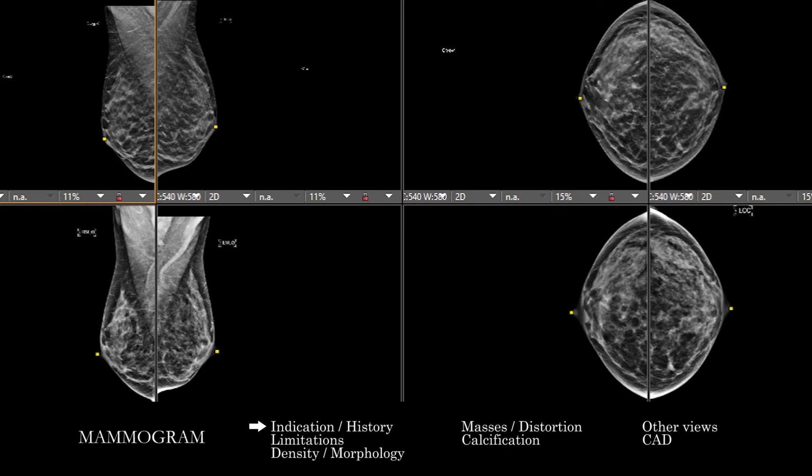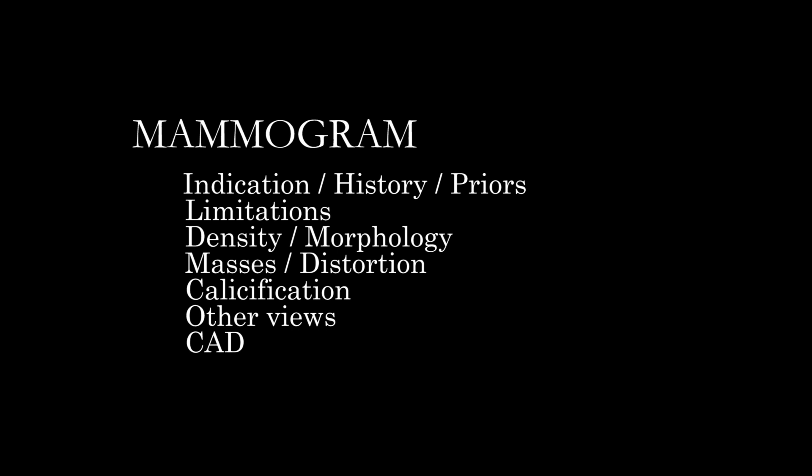Finally, once you've taken a look at all the potential abnormalities and compared them to prior on multiple views, you want to put that in the context of the patient, understand what's going on, and correlate not just within the study but also with any current ultrasound. As a recap, the overall organization for the mammogram includes: understanding patient context and history of priors, assessing study limitations and adequacy, looking at overall breast density and morphology, then looking for specific abnormalities — masses, distortions — and specifically for calcifications on 2D or synthesized 2D views, going through tomographic images for each breast and projection, and using specialized views and computer-aided detection to be more sensitive for any potential abnormality.